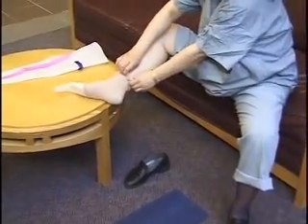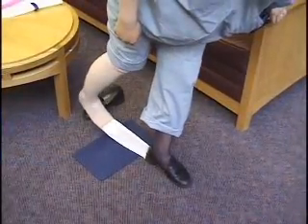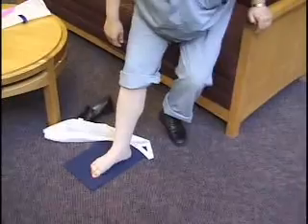I would have preferred to see her use rubber gloves, which would have made this maneuver even easier. Removal of the applier can be done simply by stepping on it with the other foot and gently pulling out the foot.